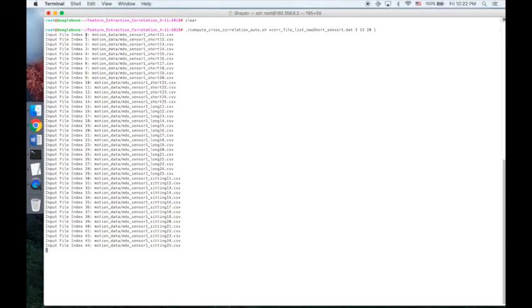Now here there are 45 input files which correspond to 15 trials for 3 types of motion, and that would be 45 files in total. The system will compute its own features, display them in a histogram form, and also output a CSV file that numerically represents the histogram. It also provides you with an integrated X-core summary CSV output that will show the cross correlation of the axis of the motion that you chose from those input files, and it does that for a pair of files, starting from here with the short stride motion.